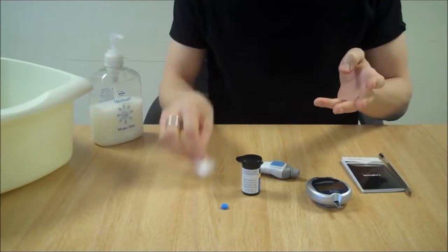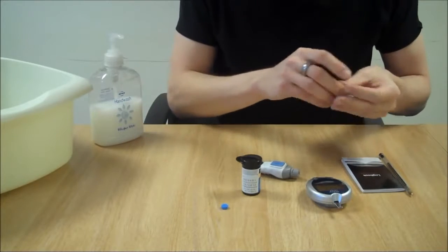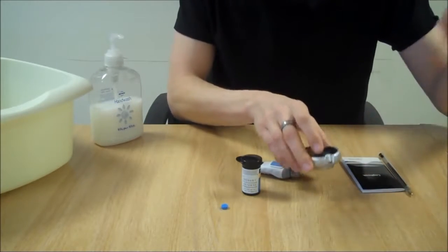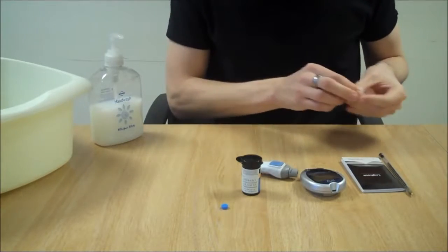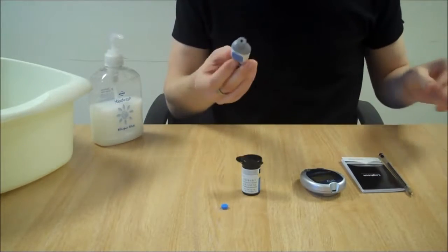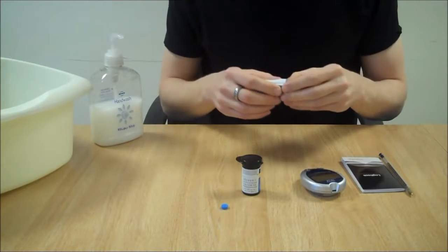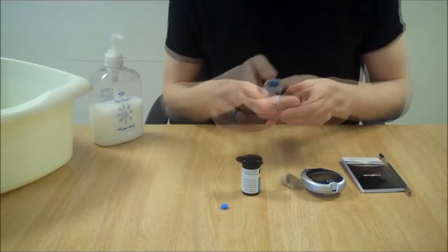Clean the blood off your finger. Remove the test strip which can be thrown away, and make sure that the lancet in the machine is disposed of in a sharps bin.